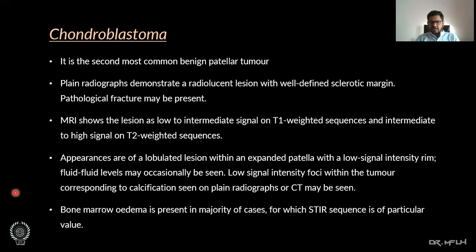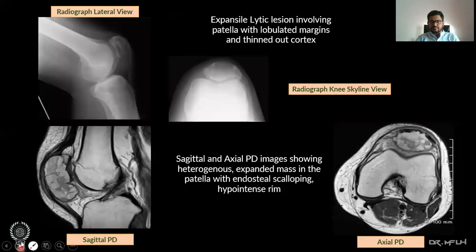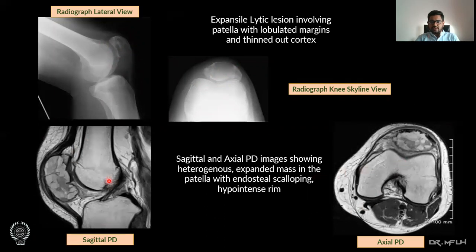Bone marrow edema is present in the majority of cases, for which the STIR sequence is of particular value. Here we can see a lateral radiograph of the knee and the knee skyline view showing a lytic lesion involving the patella with lobulated margins and a thinned-out cortex. Sagittal proton density and axial proton density knee images show a heterogeneous expanded mass in the patella with endosteal scalloping and a hypointense rim.